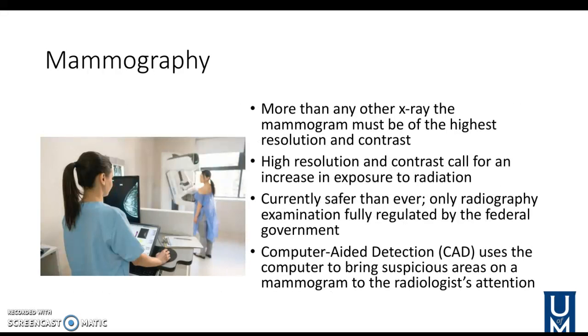Okay, so we already talked about the mammogram just a bit, but we're going to go into a little bit more detail. It's more than other x-rays. The mammogram must be of the highest resolution and contrast. High resolution and contrast call for an increase in exposure to radiation, unfortunately. It's currently safer than ever. So mammograms are very popular and common nowadays. It's the only radiography examination fully regulated by the federal government.